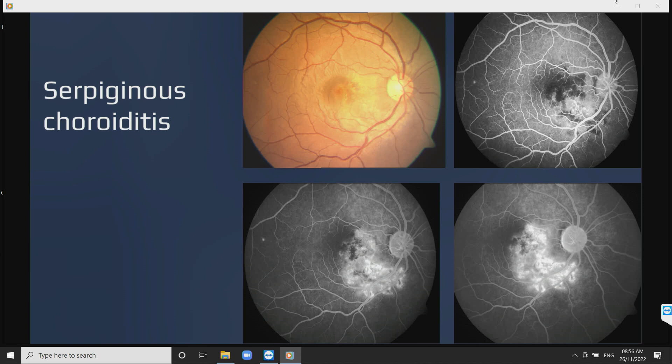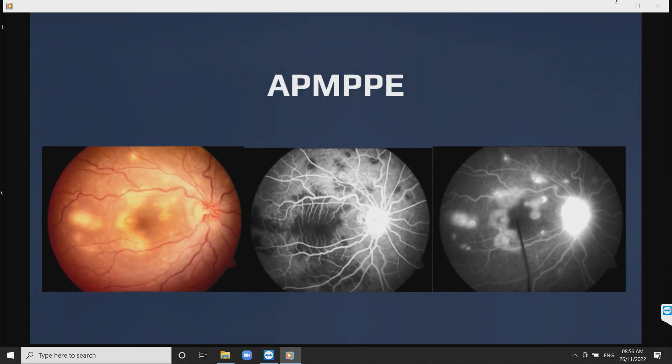In a case of serpiginous choroiditis, FFA gives the complete extent of the choroiditis and also an idea about the RPE status, which gives the prognosis. In APMPPE, FFA shows early hypo- and late hyperfluorescence, and you can see in FFA the number of lesions is much more than in a fundus photo.